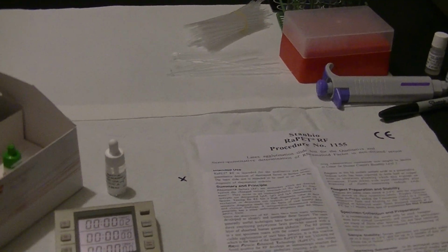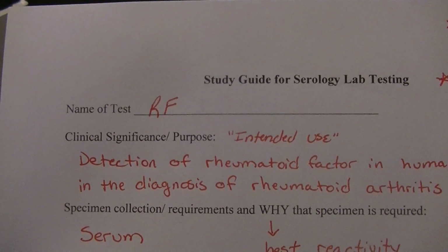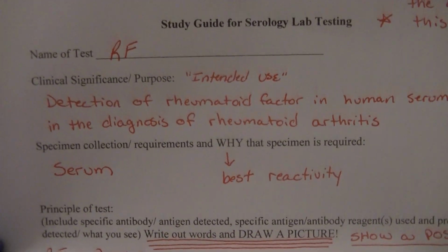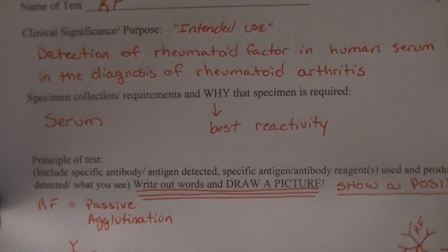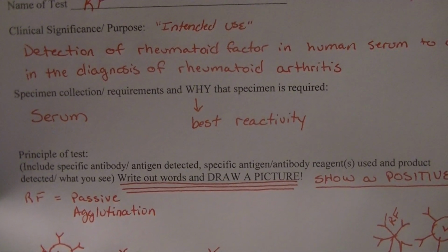So starting today, one of your assignments associated with lab is to do your study guide. So what I've done for rheumatoid factor, I have given you an example of a study guide. At the top of your study guide, you are always going to put the name of the test, rheumatoid factor. Okay? The clinical significance or purpose, in Stan Bio package inserts, they put intended use. So the whole purpose of doing the test, why is it clinically significant, is that we are detecting rheumatoid factor in human serum to aid in the diagnosis of rheumatoid arthritis.